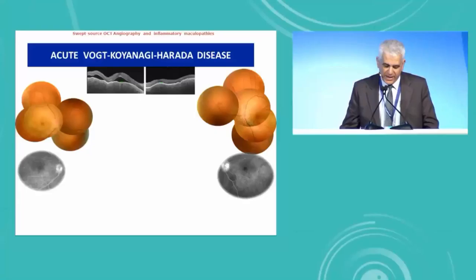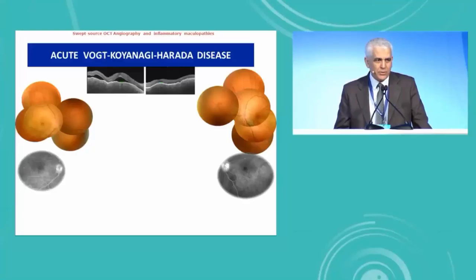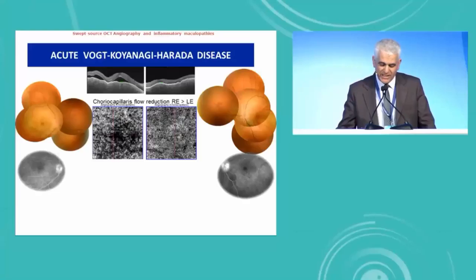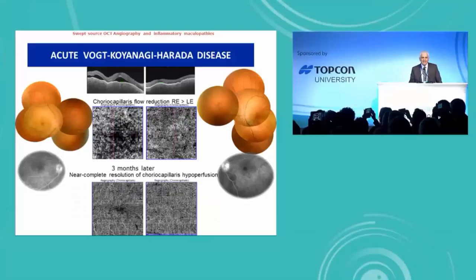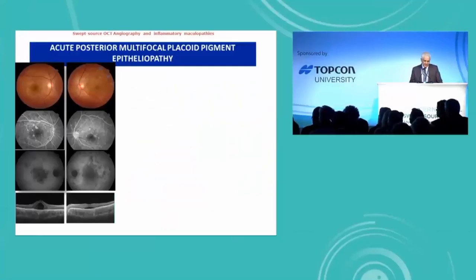The first case is a typical case of acute Vogt-Koyanagi-Harada disease. Diagnosis can be made based on typical clinical features and OCT and fluorescence angiography findings. The OCT angiography shows choriocapillaries flow reduction mainly in the right eye, and three months after treatment, near-complete resolution of choriocapillaries hypoperfusion.